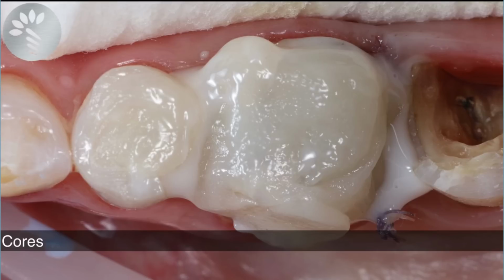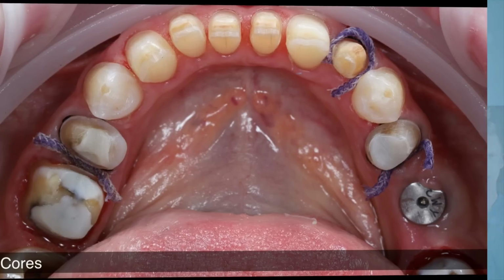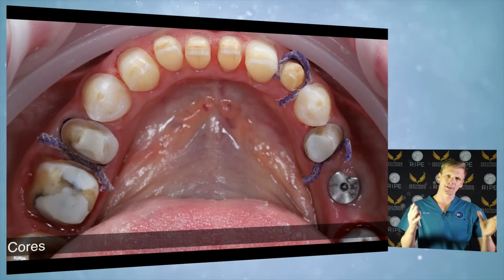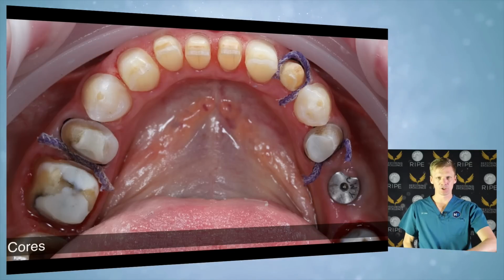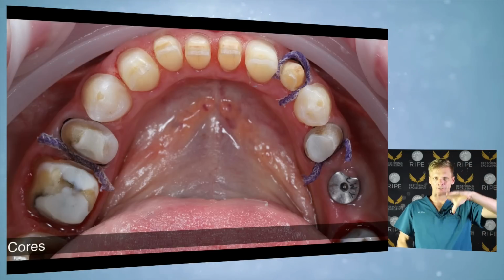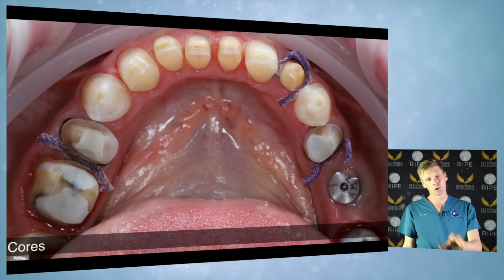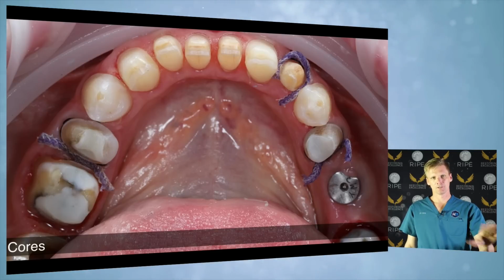And here's that case. So on the left-hand side of the picture, those are the cores that I did in the preceding picture, okay? But I did all the other ones as well today. Those cores now give your tooth a nice, smooth, flowing shape, easy for silicone to run over. And if you're going to prep a margin, it's easy for it to run down the side and hit the margin and give you a nice crisp line. If you have a bumpy thing, it's much harder for the silicone to flow. Okay, it's not the end of the world. I'm sure you can make it work. It's just all these increments add up to getting the perfect impression first time.